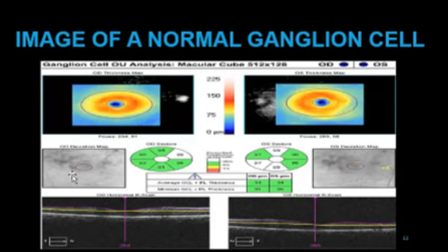So now this is the deviation map. Remember, the deviation map is comparing whatever the patient has with his age group. In the deviation map, when you see a clear, whitish, or grayish color, it's indicating that everything is okay. When you see yellow or red, yellow indicates that something is going on but it is minor, and red indicates that something serious is happening. How do I know? I can see it from this chart here. No, white is above normal. The green is for the 95%. The yellow is for the 5%, and the 1% is for the red color here.